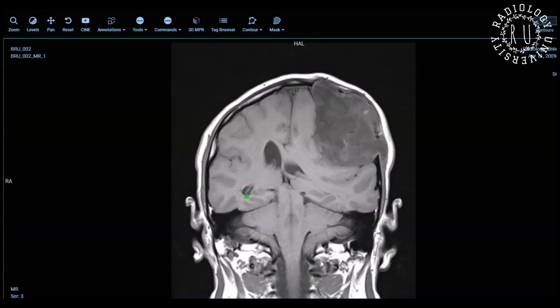I think there are other imaging modalities such as nuclear imaging that may be helpful, like the FDG PET scan, that may forego the need for biopsy. It will show high uptake, then what will you do in the nuclear? True. Because any extra-axial lesion, it's always hyper.